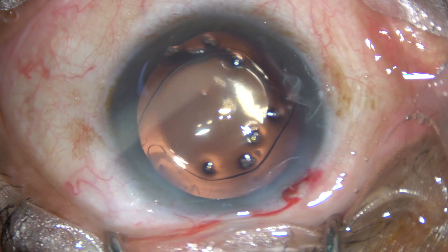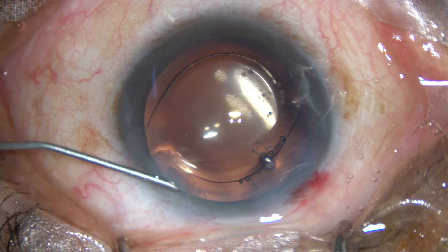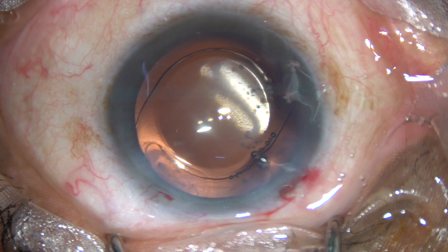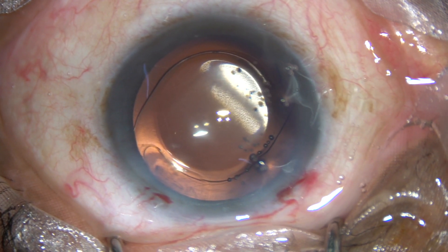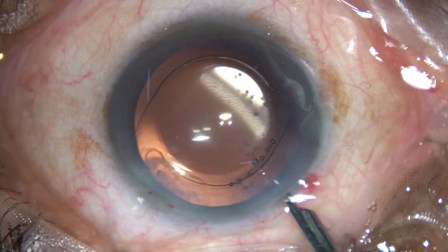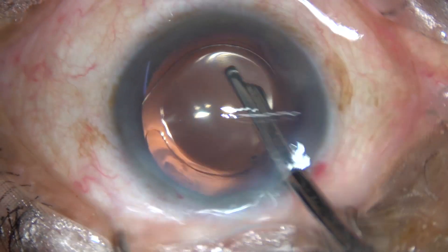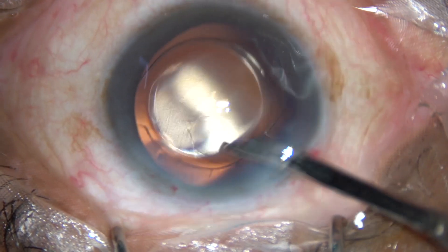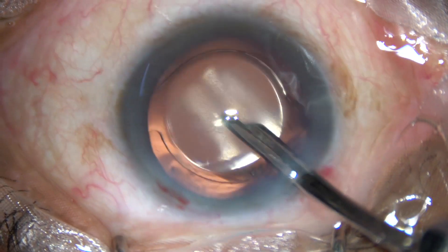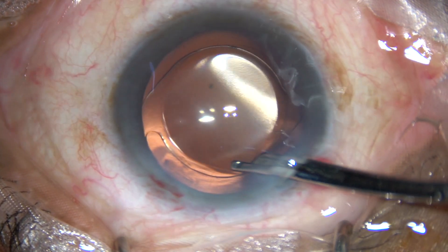This is a bit of moxifloxacin. The only side port on the left side of the main incision is hydrated to make this stab incision waterproof. The main incision in my surgeries doesn't need any hydration. This is a final lavage of the anterior chamber with clean fresh BSS, so all particles are removed. Any small bits of viscoelastic substance, and visco sticking to the corneal endothelium, come out at this time.